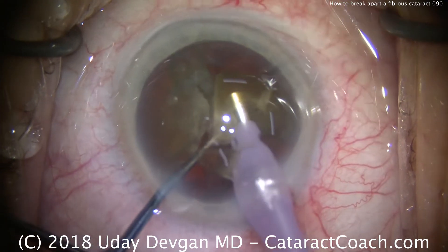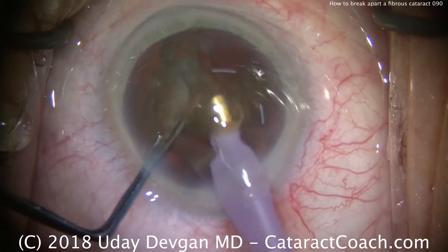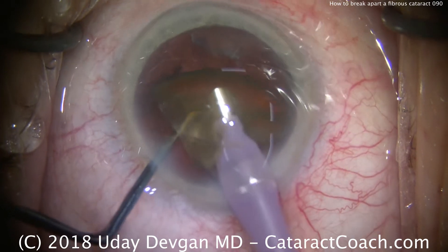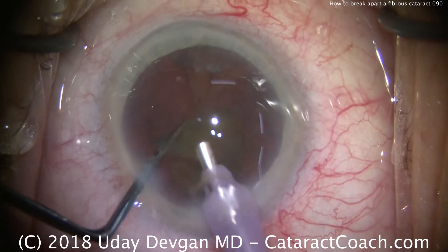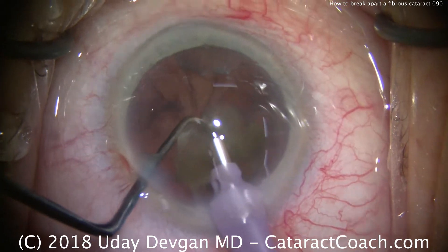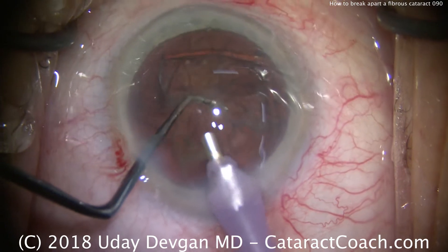Be sure to use phaco power modulation to minimize the total energy placed in the eye. When we're doing these nucleus removal pieces, we're doing it at the iris plane — you don't want to be up against the corneal endothelium. Chopper in a protective position to keep the capsular bag at bay. Taking out the last piece of the nucleus, and that looks pretty good.